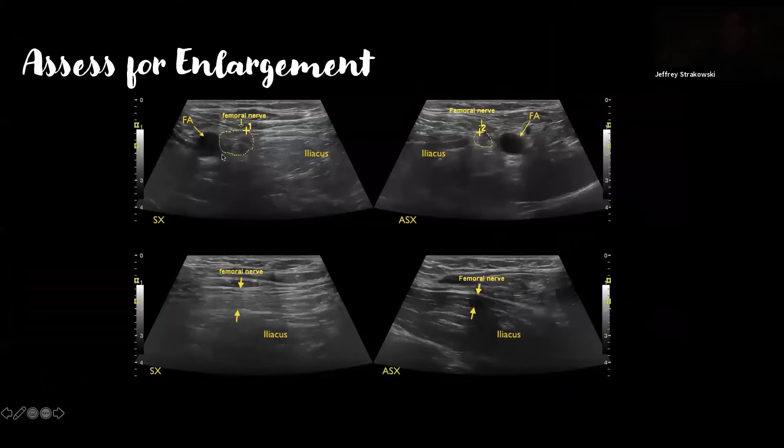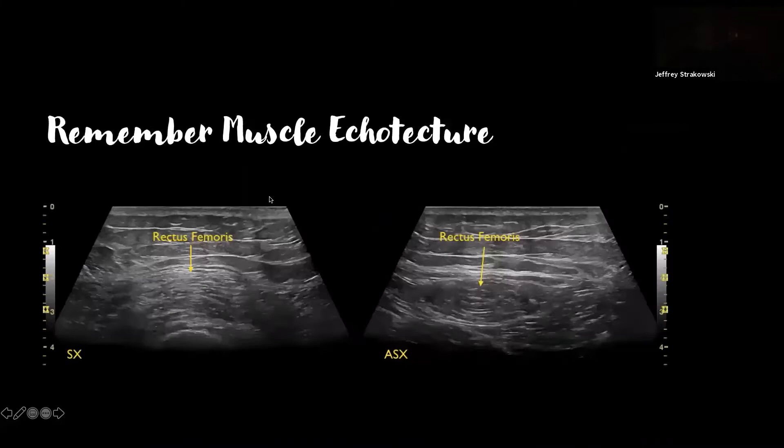Doing side-to-side comparison is helpful, especially when not familiar with these nerves. Look at the difference between this diffusely enlarged femoral nerve from a stretch injury and hip dislocation compared to the normal femoral nerve on the opposite side — it's grossly enlarged all the way through to the point it starts to branch. For complicated nerves with complicated courses, we can gain a lot of information by looking at muscle architecture — this is the denervated rectus femoris on the affected side compared to the same level on the unaffected side.